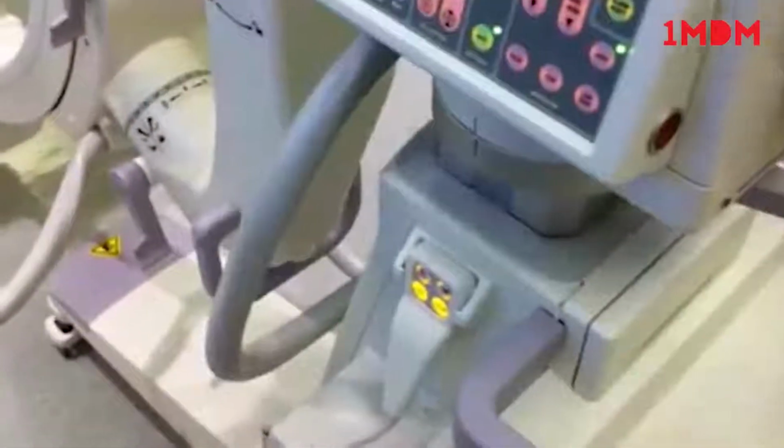Yeah, I guess I could quickly show what the GE Smart View does. Might as well. I sound like a GE rep. All right, here we go. Let's get this into lateral. Let me just unlock this lock now. It's hard to do one hand. All right, let's get this into lateral. Let me just hold this down so I can lock my locks. Okay, let's lock it down. Okay, flip this and disconnect this. So, it's automatically tilting.